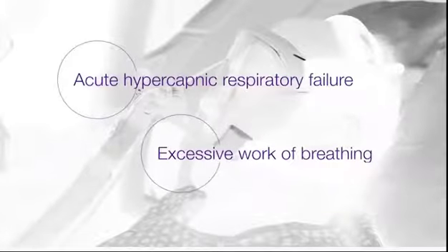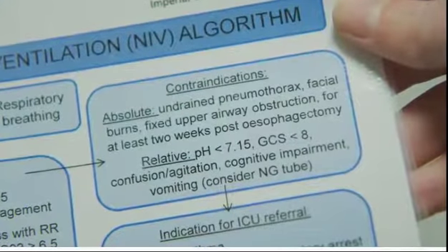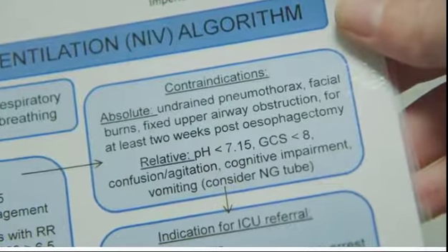It is important to identify the clinical indication for using non-invasive ventilation. If used inappropriately, it can make the clinical problem worse. Before starting NIV, it's important to check there are no contraindications to treatment. Therefore, before starting NIV, you should ensure the patient has had an ABG to determine type 2 respiratory failure unless they have excessive work of breathing, and ensure the patient has a chest X-ray to rule out a pneumothorax.